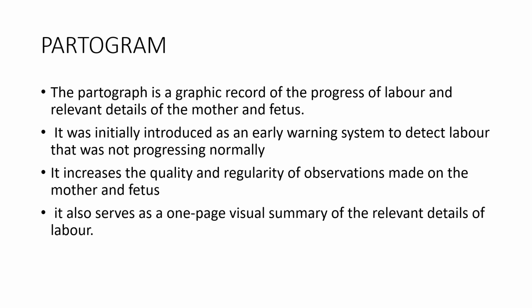And we can diagnose from it arrest of labor, delay of labor, and actually it increased the quality and regularity of the observations made on the mother and fetus.